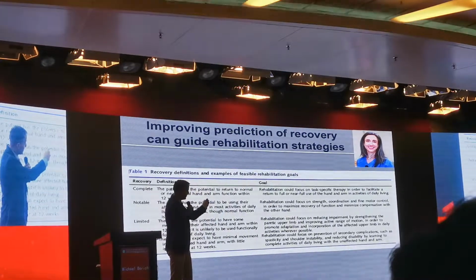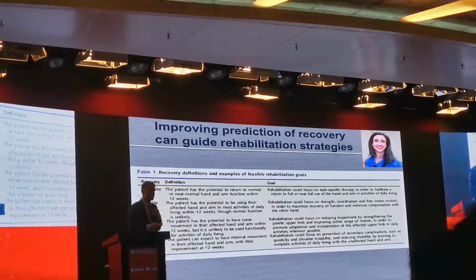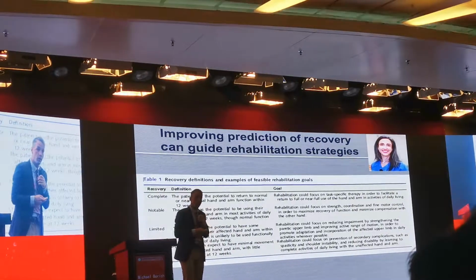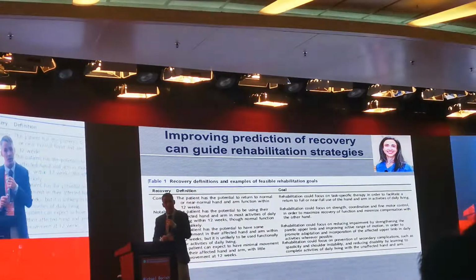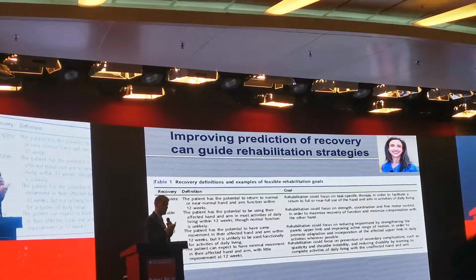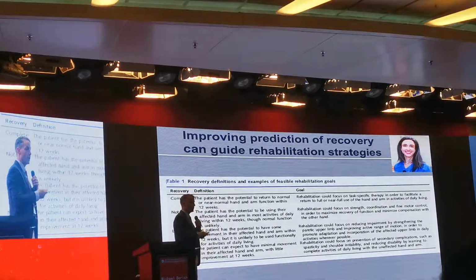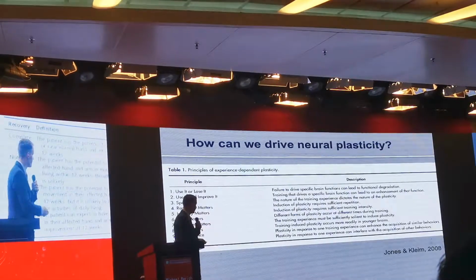So Mary Alice here in the upper right corner, she's actually looking at, does this work in a hospital setting in the States? And if it does, how does that improve our ability to treat our patients? So this is one way where we're using TMS, a very simple way of applying TMS to be able to assess the functional integrity of pathways critical to the ability to produce movement. And if we have that information, we now have a better opportunity to understand how an individual will likely recover.